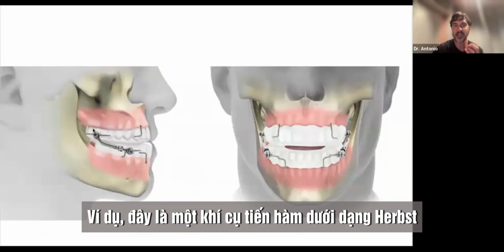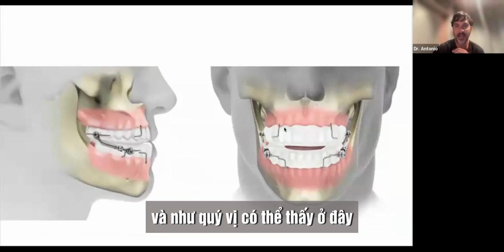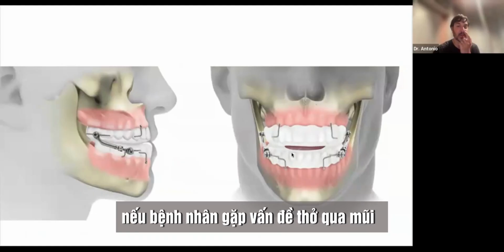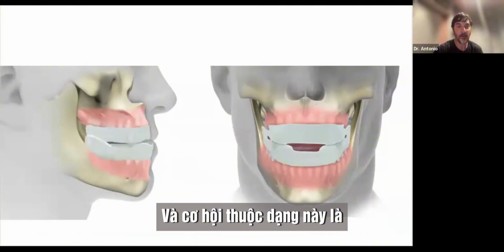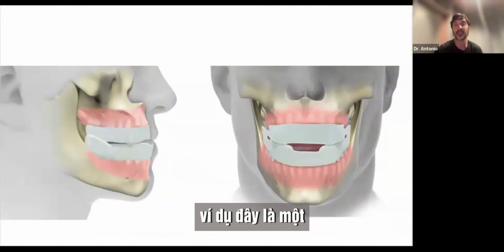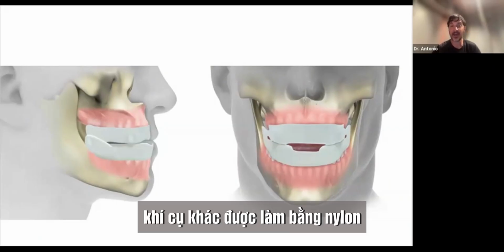For example, this is an Herbst-like mandibular advancement device, and as you can see here, it has an anterior channel to guarantee oral breathing if the patient has some problem breathing through the nose. And this kind of opportunity is possible in many devices. For example, this is another device that is made in nylon.